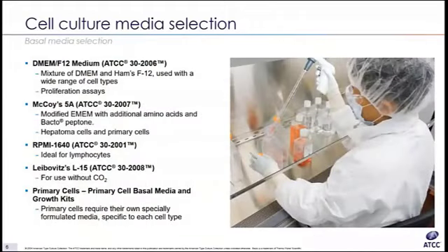Continuing to look at basal media formulations, we have DMEM F12. This medium is a 1-to-1 mixture of DMEM and Ham's F12. It's an extremely rich and complex medium, and it'll support the growth of a broad range of cell types in both serum and serum-free formulations.